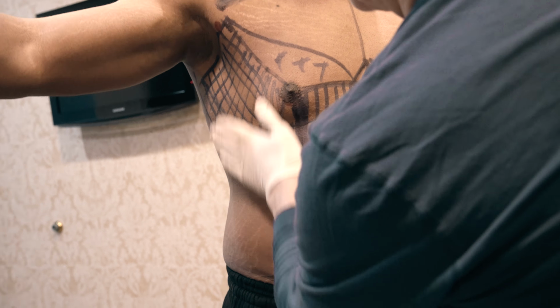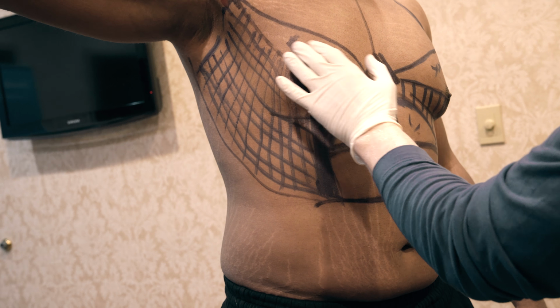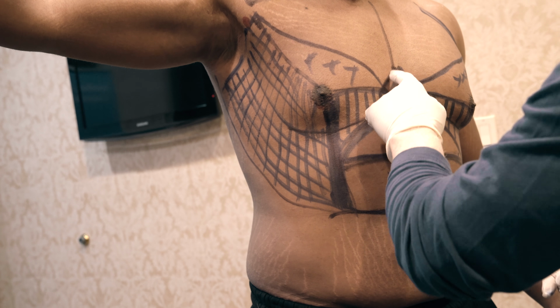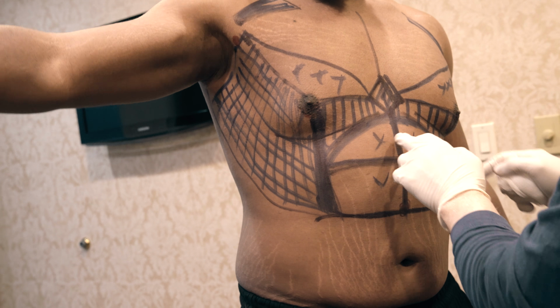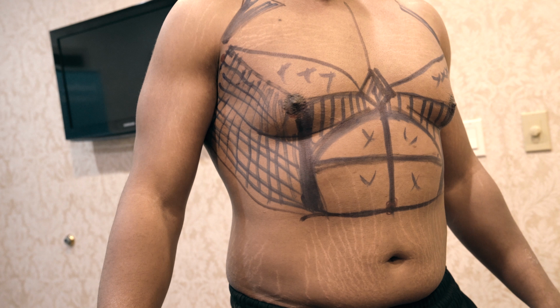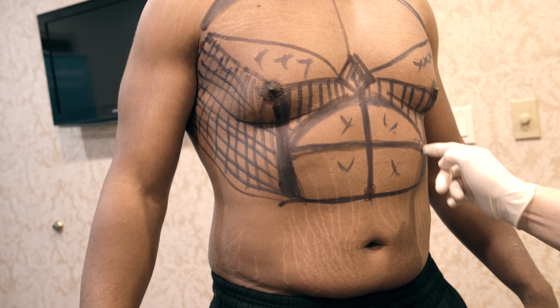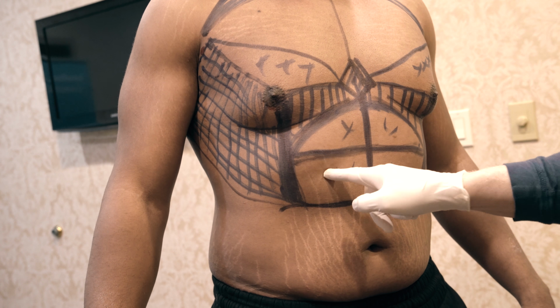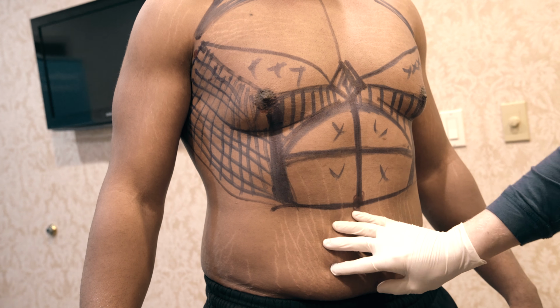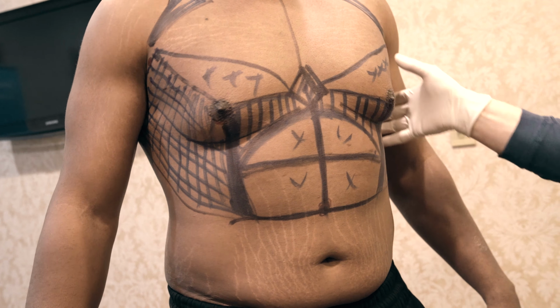Going to empty all the space, this hatch mark here, empty that really down, kind of a transition zone over here to leave some volume here and don't touch anything up here. This little rhomboid shape here is kind of nice and gives us the male cleavage right in the center, so the nice separation of the pectoralis major muscle. Empty this space nice. The first 6-pack is more of a curve, and then the second one is bigger, and the third one goes down here, which we're not going to touch. Because if I do the third one, then I got to go way down here and around, and that's a different operation. Again, empty everything.